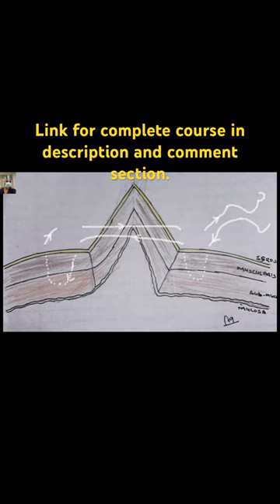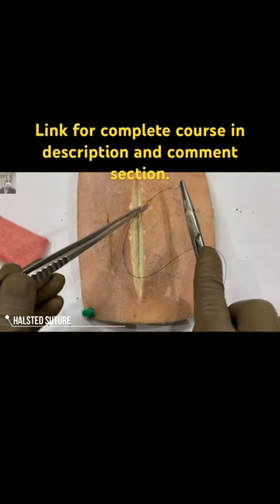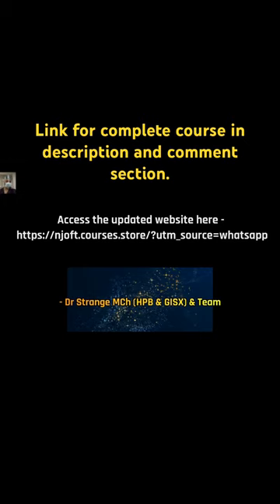This is the pictorial depiction of the Halstead suture. We start from one end, followed by a continuous Halstead suturing pattern. We start approximately 8 mm from the edge.